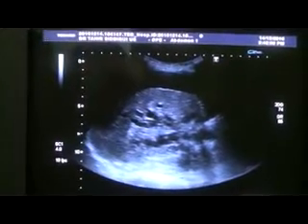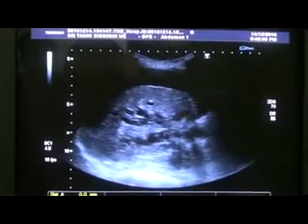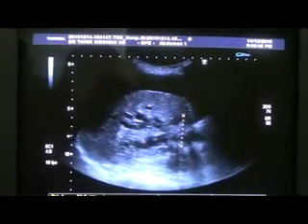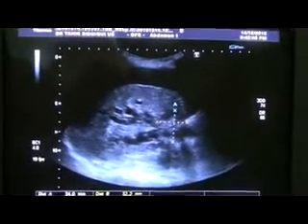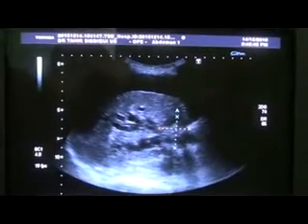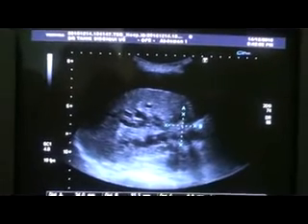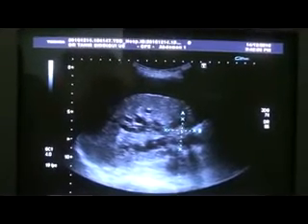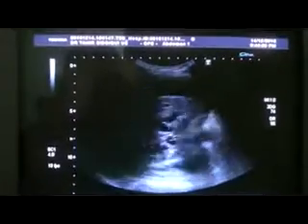Concentrate over here. This is a focal mass measuring 34 by 32 millimeters with dilated bile ducts, and you can see that the bile ducts are converging. This is giving a pressure effect on the CBD, causing the bile ducts to be dilated.